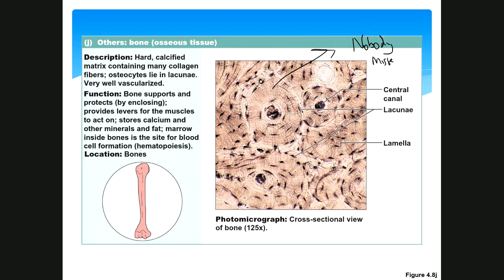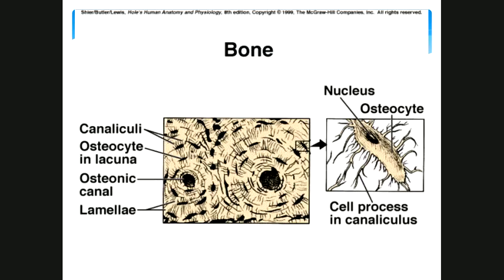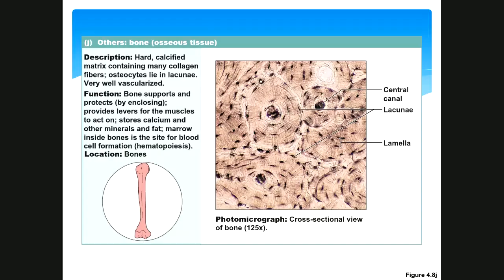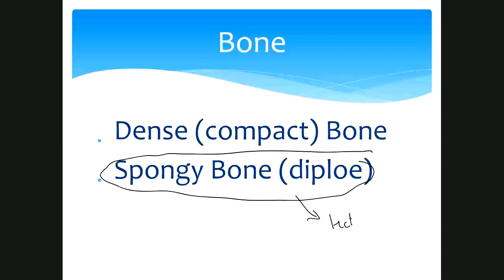So that's dense bone. We also have spongy bone, but spongy bone is not set up in the lab, and so I didn't set it up on here either. But if you want to know about spongy bone, you can go to the lecture PowerPoint, the lecture Collaborate, and I talk about it there.